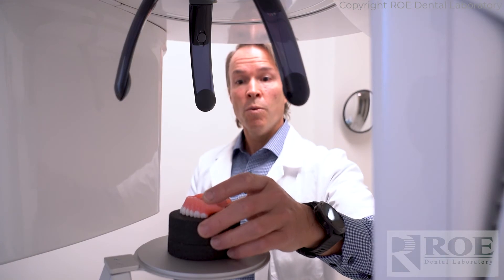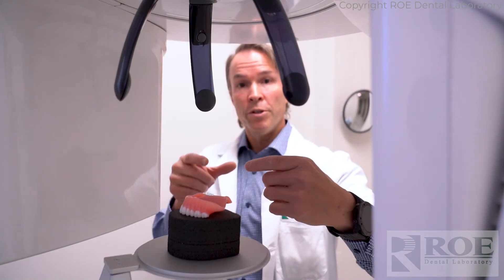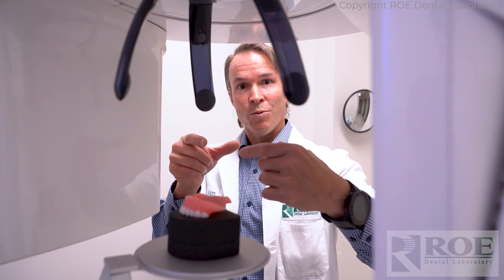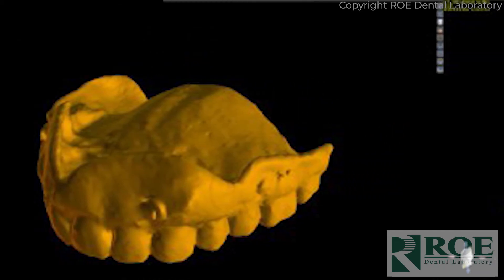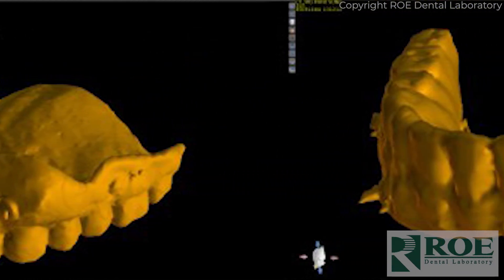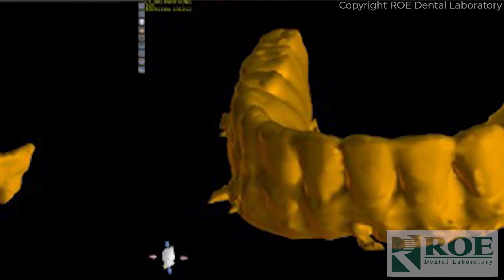Foam works, and even if you have a hard surface, you can balance the denture up on cotton rolls and that'll work just fine. Scan it upper or lower, teeth up or teeth down — it doesn't matter, just have it floating on foam or similar support.